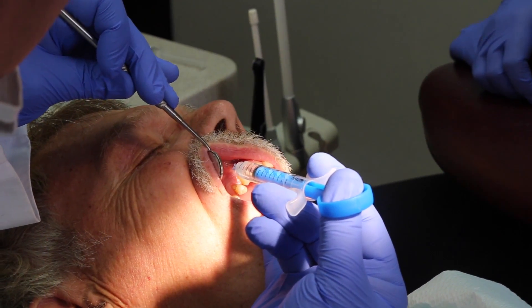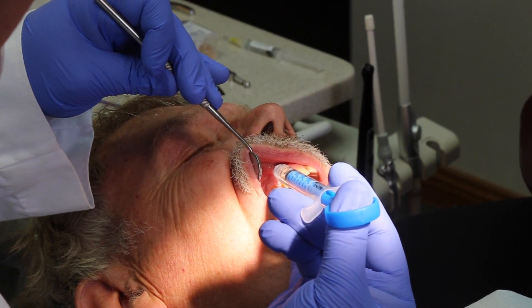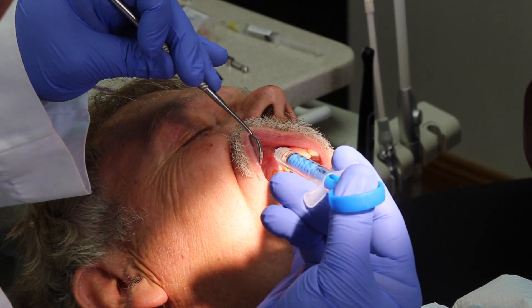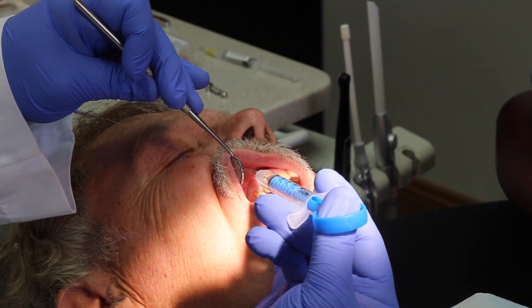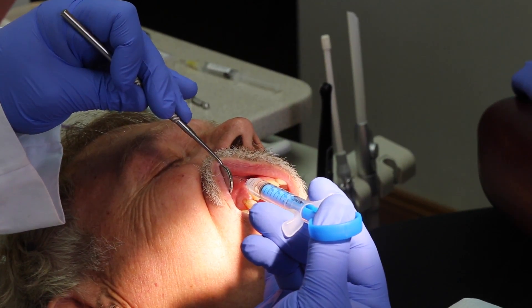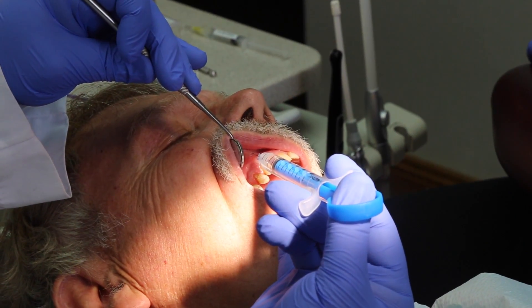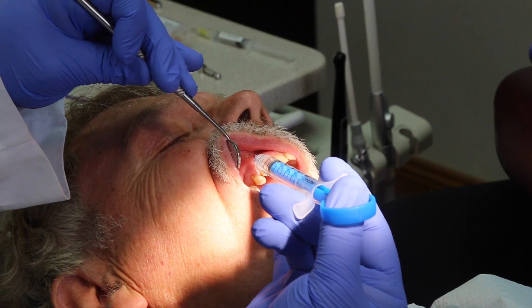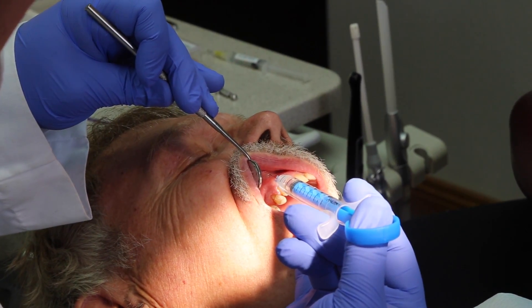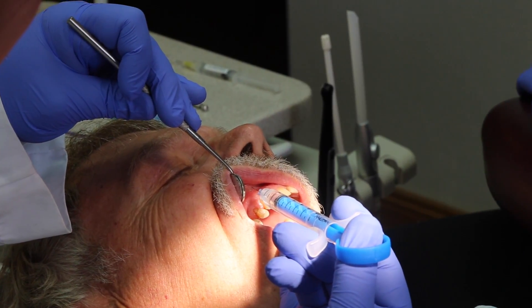I usually take about a minute to a minute and a half for each injection. So far we've delivered about half a ml — a normal carpule is 1.8 mls. We only drew up the amount of anesthetic that we thought we might need. What I find consistently is that we use a lot less anesthetic than we would normally, and there's a lot less waste.